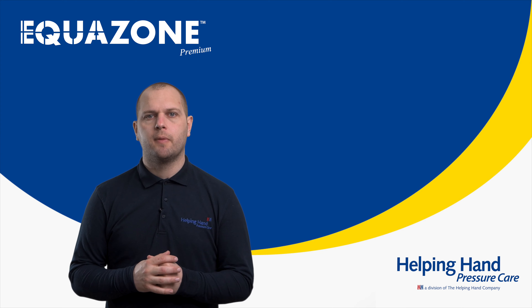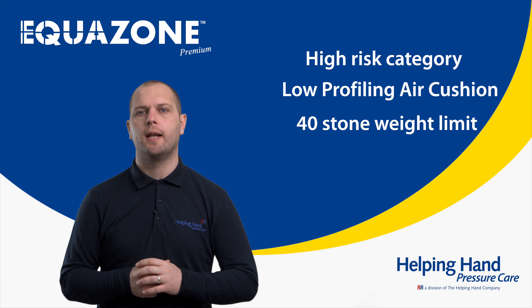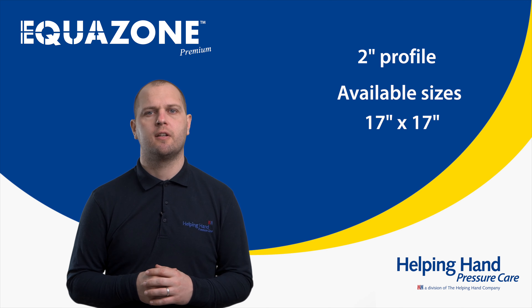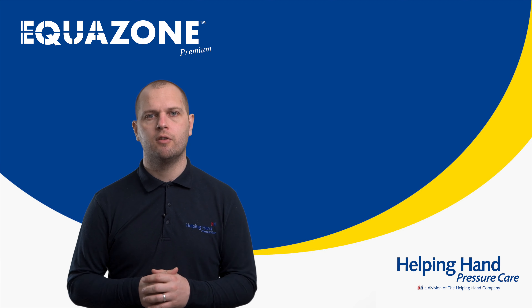There you have it — the Equizone Premium, our high-risk low-profiling air cushion with a 40-stone weight limit. Available in one height of 2 inch and sizes of 17x17 or 21x19. To find out more, please visit our website or give us a call.